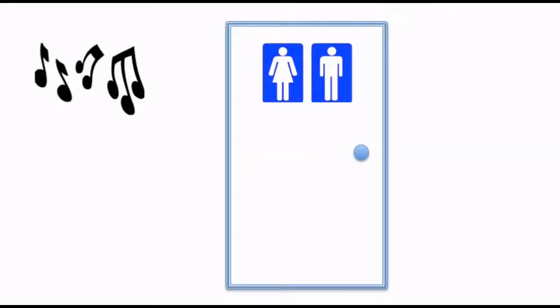A more concrete example of how a dense object is a high frequency filter is to think about the bathroom door at a music club. When you are in a music club, you hear a mixture of both high and low pitched frequencies. However, when you go to the bathroom, usually you only hear the thumping of the bass, the low frequency, after you close the door. When you are finished and open the door, all of a sudden high frequency becomes more obvious. In a similar way, the skull acts like the bathroom door, filtering out some of the high frequencies and leaving only low frequencies. When there is a breach, it is as if the door is open in one particular place, and so high frequencies leak out and are seen more easily.